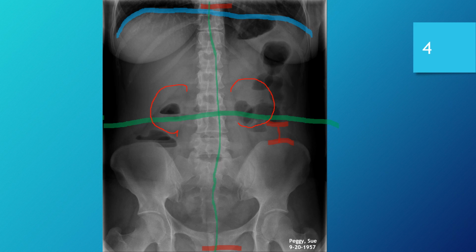So being able to visualize those aspects is a very good indicator that your technique was good. We also have the profile of the psoas muscles here on both sides bilaterally, so that's good. Definitely something that you want to see. And overall the exposure properties for this image were very good. Excellent choice of technique for this exam.